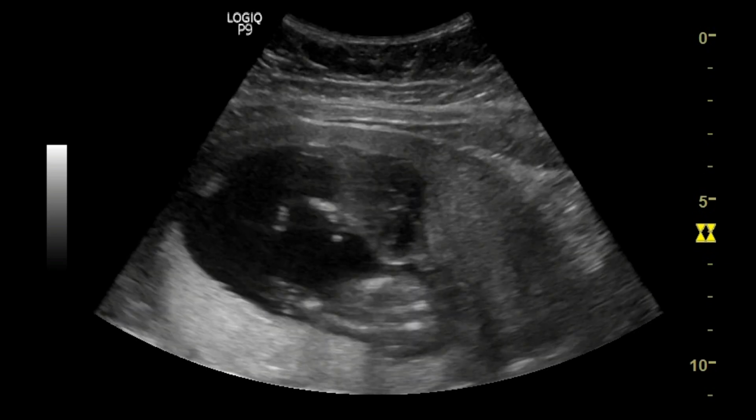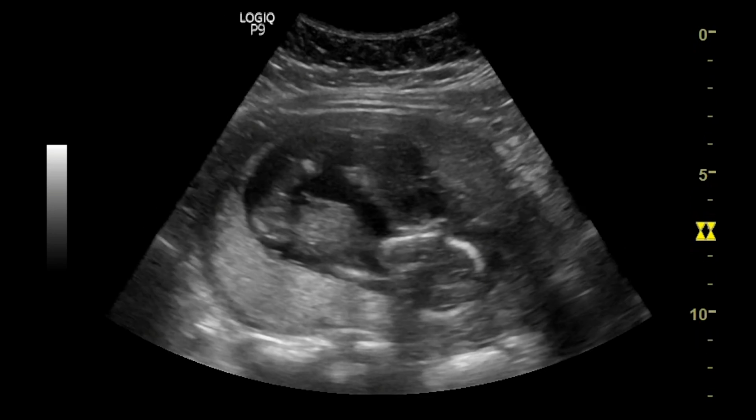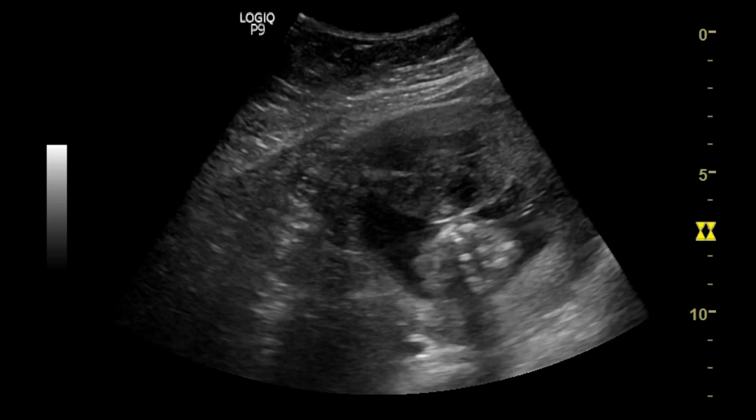Here we can see a placental hematoma. You can see tone on upper limb as well as good fetal movements. It's very early case for biophysical profile, but we used it to demonstrate normal movements.